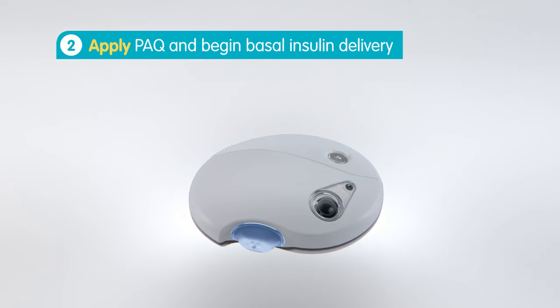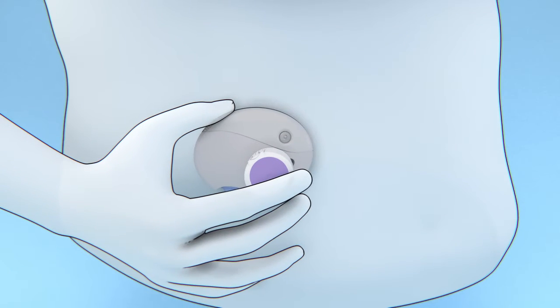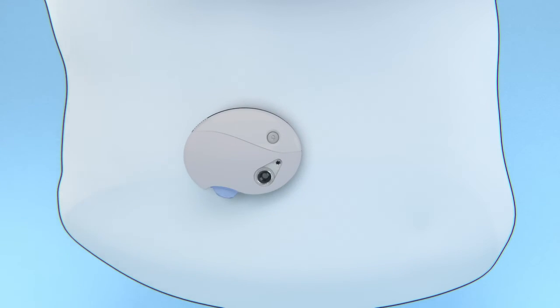To apply PAQ, simply remove the paper from the adhesive tape. Press the adhesive side firmly against the abdomen to secure PAQ. Then press the device to insert a small flexible tube called a cannula into the abdomen. PAQ is set and delivering the preset basal insulin rate.